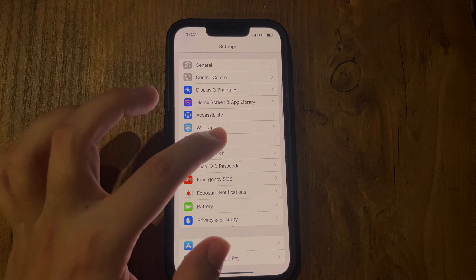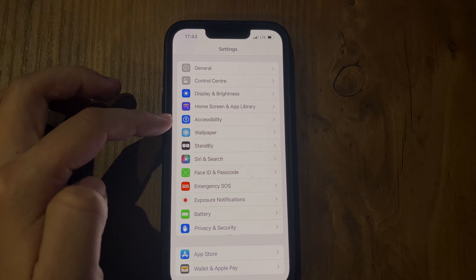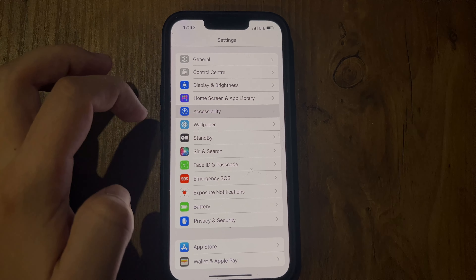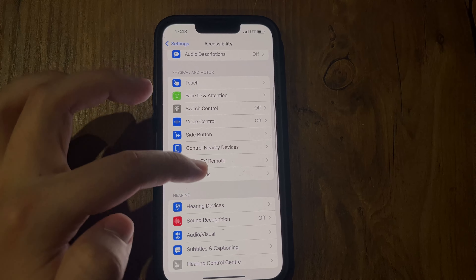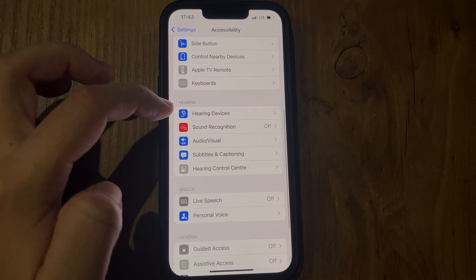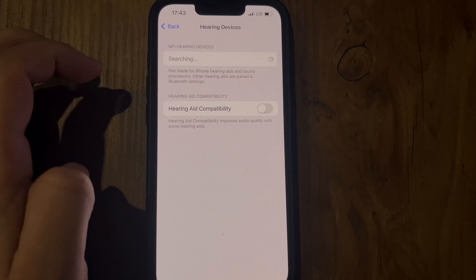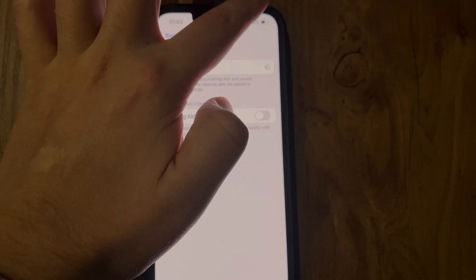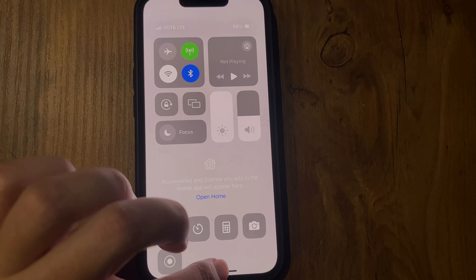Tap Accessibility, then Hearing, then Hearing Devices. Turn on Bluetooth, then turn your hearing devices off and back on again.